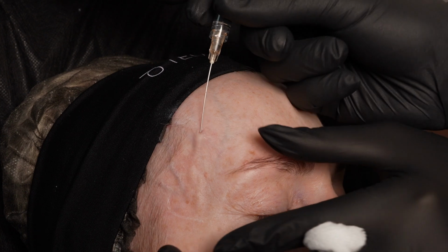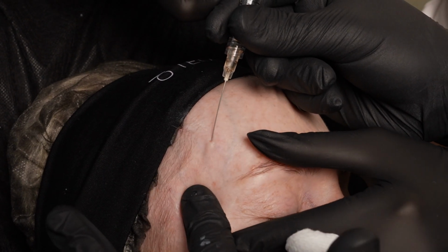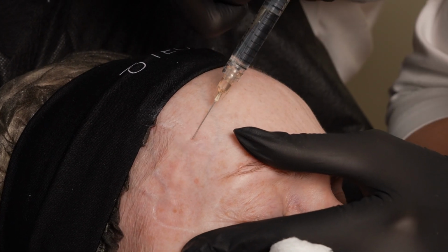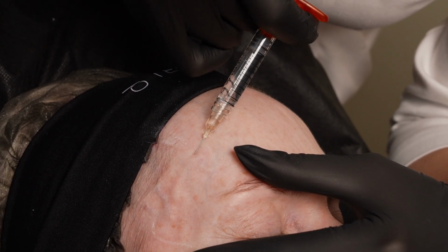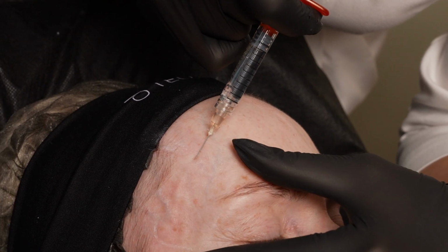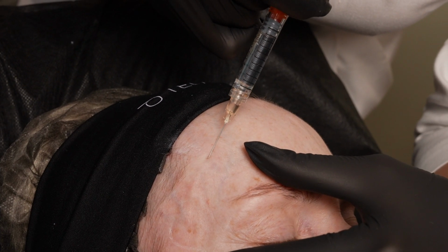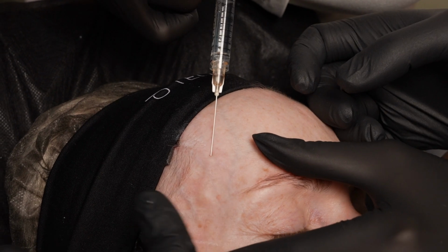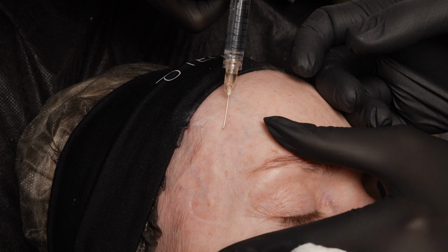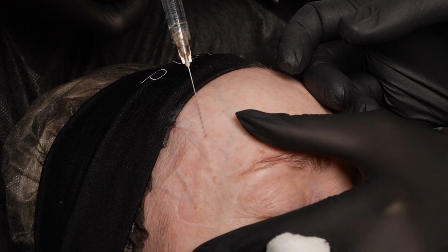Perfect. Super. Here. Inject more. Perfect. Super. Here a little bit.